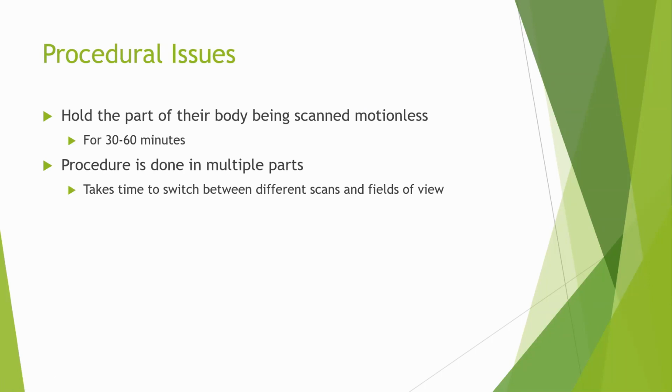And it takes time because multiple parts are taken in sequence. So it just takes time to switch between different scans and fields of view. That's basically it. All right.